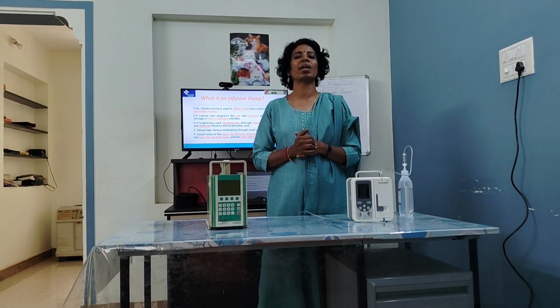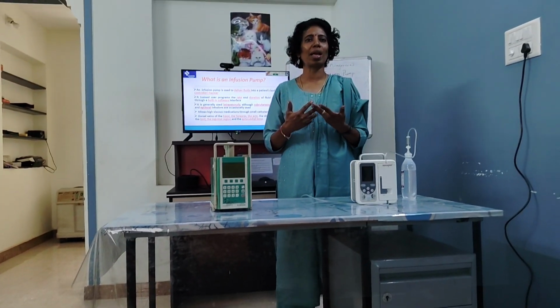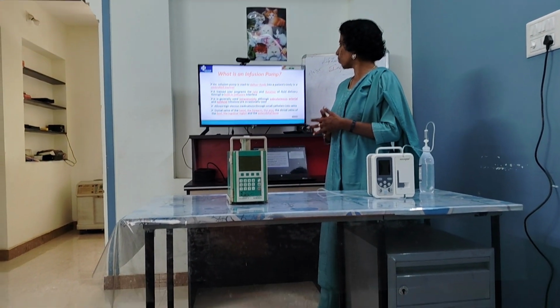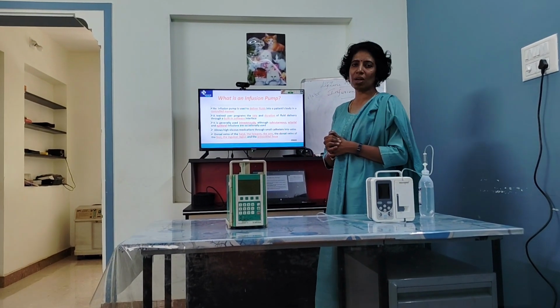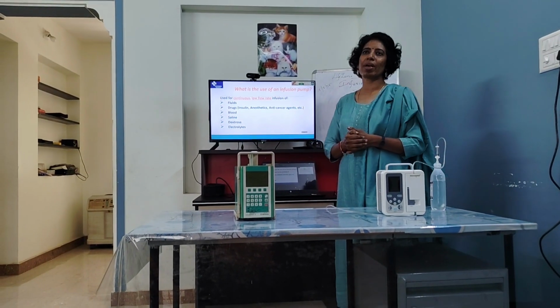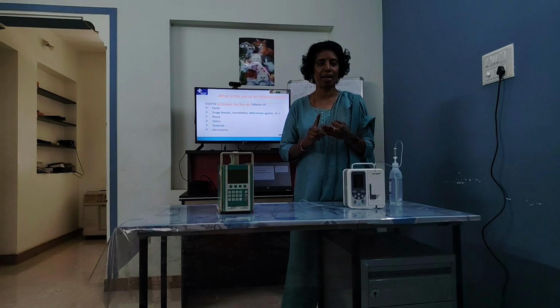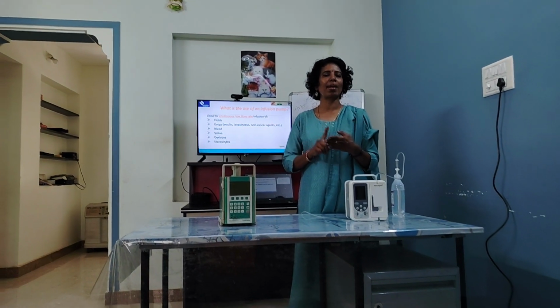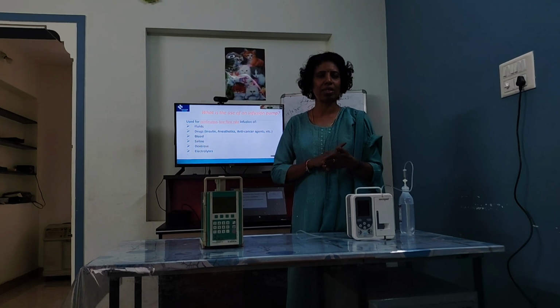Apart from IV, we can also send it subcutaneously, in the arterial area, in the epidural area, and it can be infused to other sites like the antecubital fossa, etc. What is the use of an infusion pump? We can administer fluid, we can send blood through the infusion pump, we can administer saline, electrolytes, medications like insulin, and we can send anti-cancer drugs, etc.